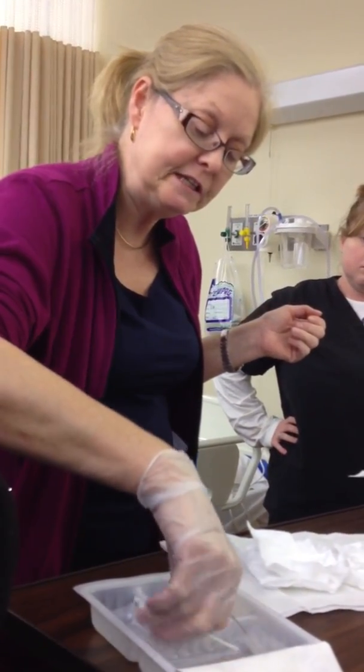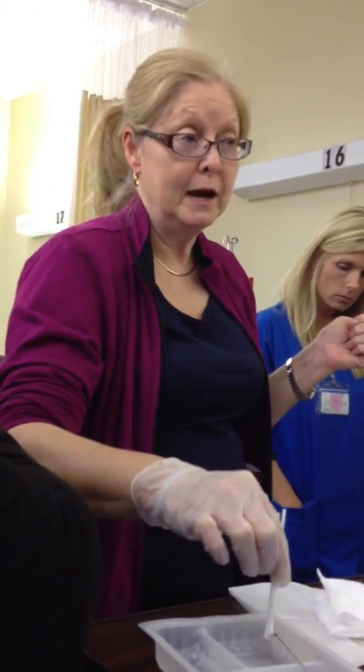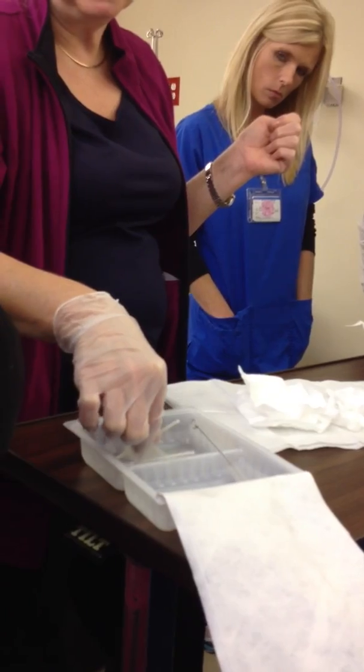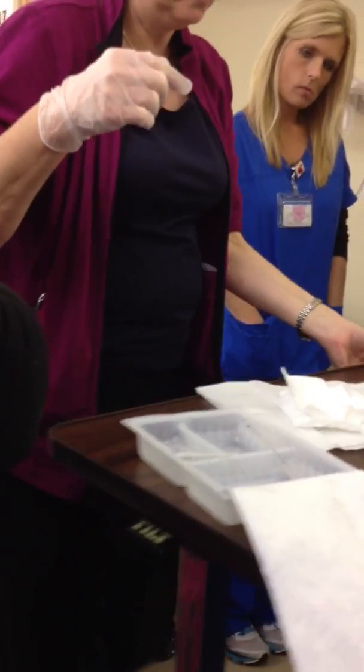So now you see that this has 3 compartments in here. And so now we have to designate what we're going to put in each compartment. So what I'm going to do first, the largest compartment I'm going to mix with my pure hydrogen peroxide. I guess this will be my rinse here. So that'll be my clean. So I'm just going to leave those in place so I'll kind of know what I've got going here.